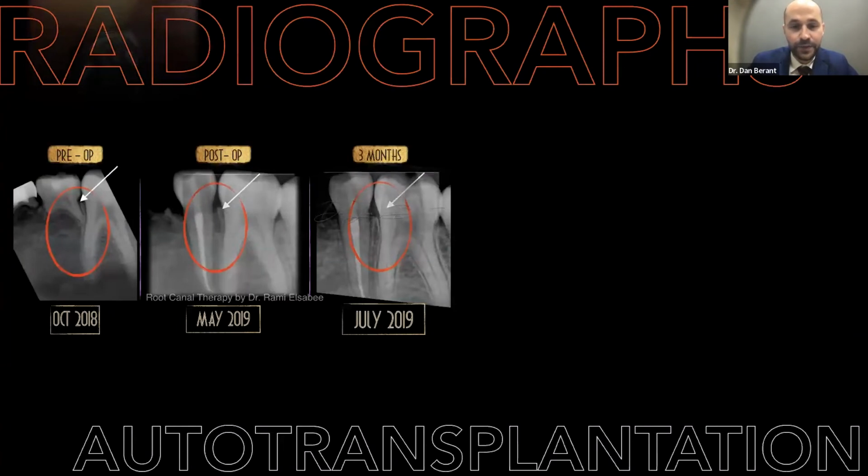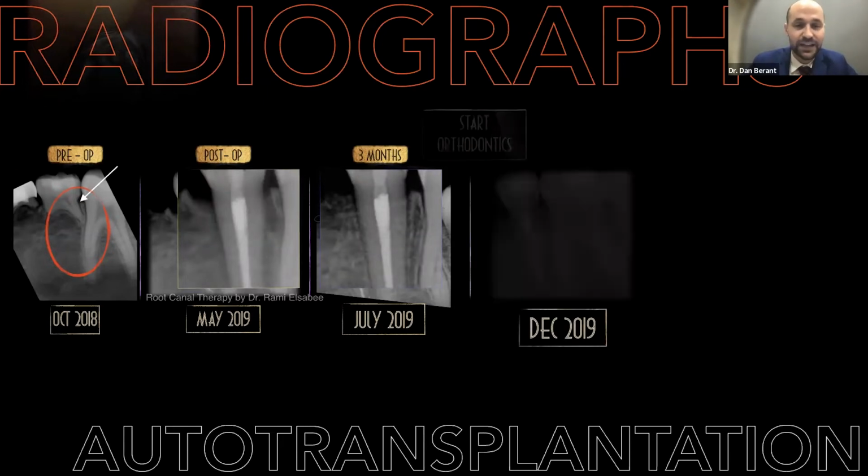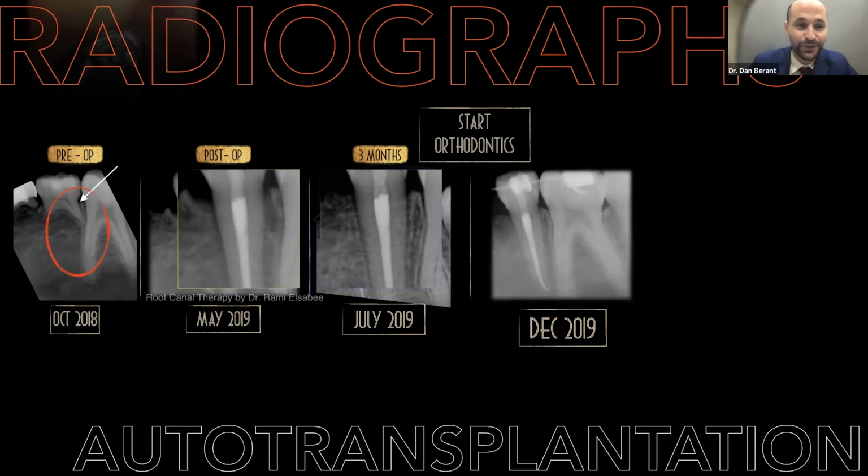And then if we take a closer look, we can see how beautifully the PDL has healed in that site. Now, again, it appears like lamina dura, but in order to truly tell, we'd have to take histological samples, which would go completely counter to a lot of principles and what we want to do. And one way to tell, though, we could do orthodontics.